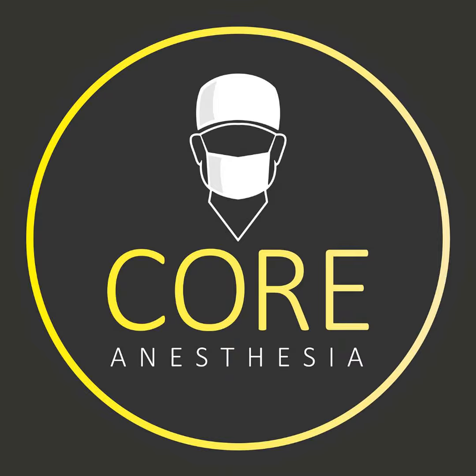All right, so that's epidural. Let's move quickly into spinal. This will be a much shorter portion of this discussion, simply because we've already covered a lot of the same techniques that we'll discuss here with the spinal anesthetic. The goal here is to gain access to the CSF. While with the epidural, that's really something you don't want as you're placing the Tuohy needle, this is actually the goal of the spinal anesthetic, to achieve that cerebral spinal fluid coming out of the intrathecal space.